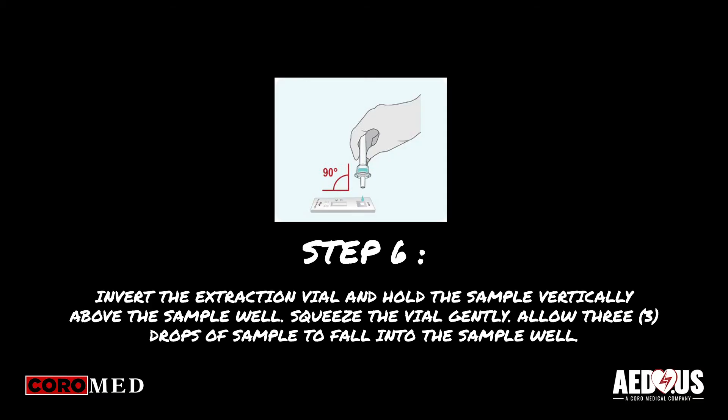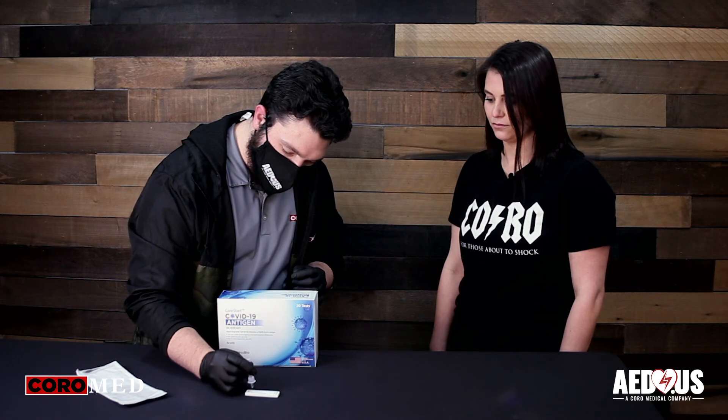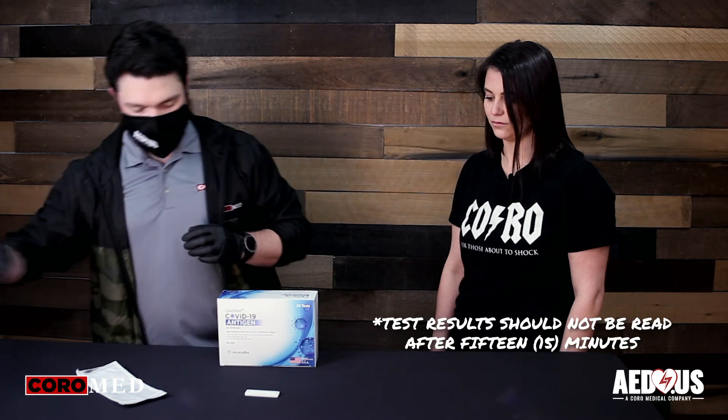Lastly, invert the extraction vial and hold the sample vertically above the sample well. Squeeze the vial gently and allow three drops of sample to fall into the well. At least two drops are required to initiate the test. Now start the timer and wait 10 minutes to interpret the results.